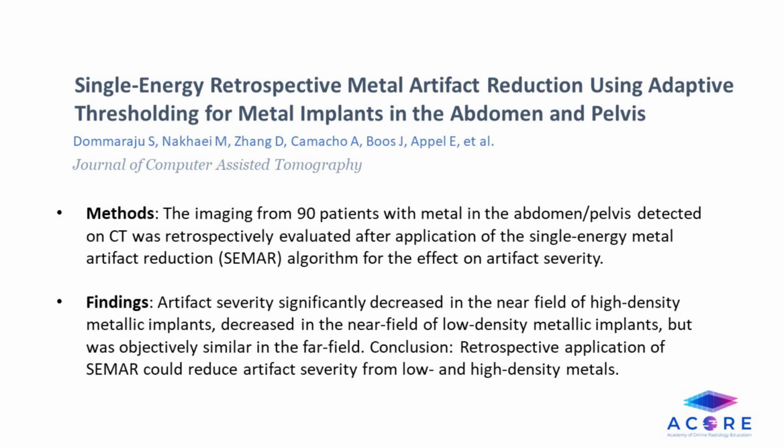decreased to some extent in the near field of low-density metallic implants, but was objectively similar in the far field of low-density metallic implants or high-density metallic implants. Subjectively, the artifact severity was found to be decreased all around. They concluded that the retrospective application of SEMAR could reduce artifact severity from both low and high density metals, both objectively and subjectively.